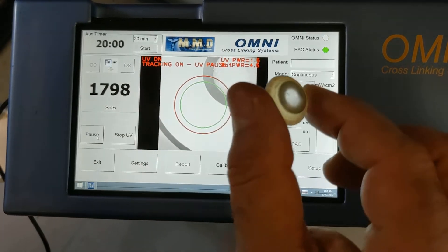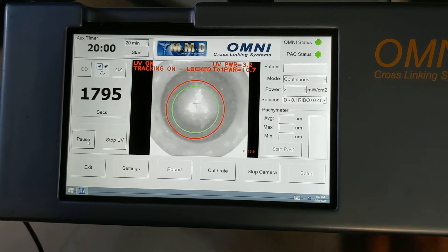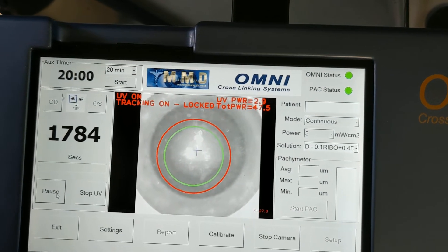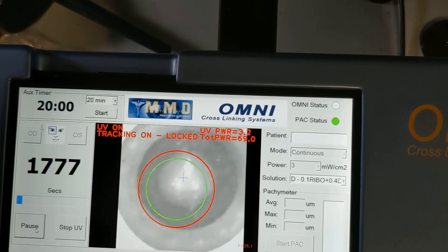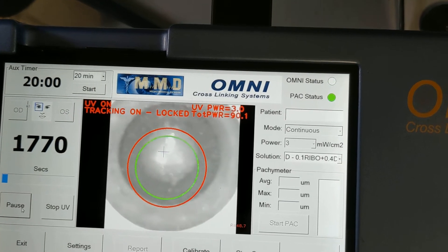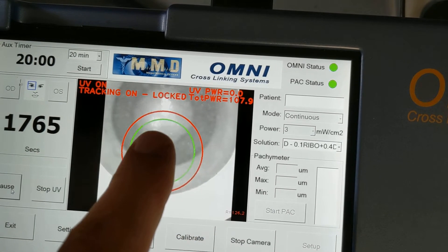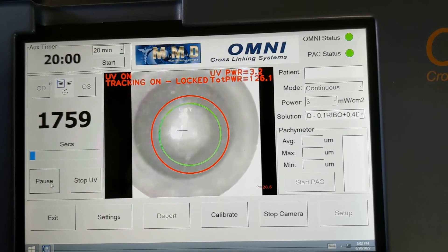I'm placing an eye underneath the device. You can see the tracking is locked and the UV power is sending at about 3.2 or 3 milliwatts. The total power is being accumulated. As the eye moves, the tracking keeps tracking. If I move too far away, it pauses — the power goes off. When I bring it back in, it locks and the power comes back on.